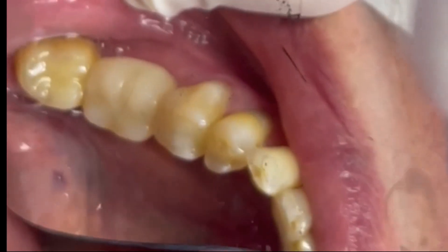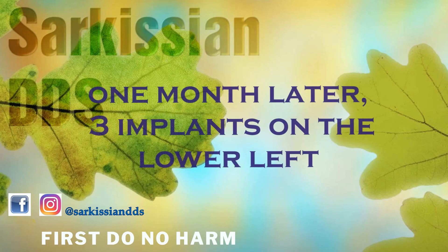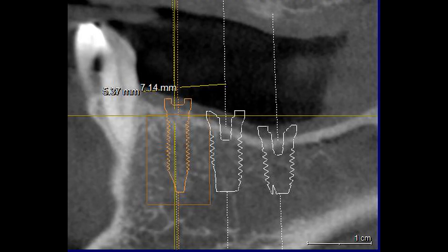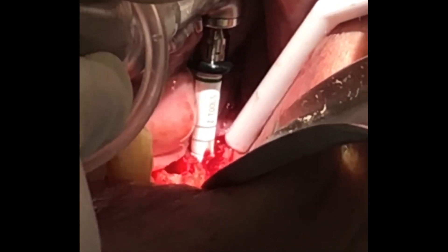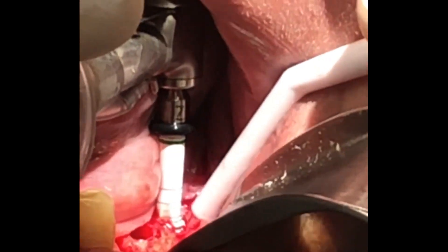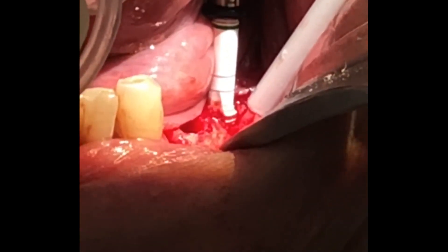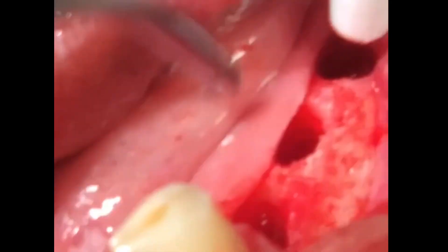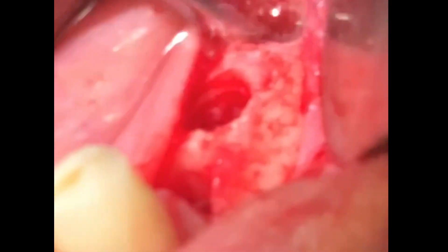This upcoming segment, where we place three implants on the lower left ridge, was one month after the implantation of the first implant on the lower right. We follow the same principles, just with a little more meticulous planning on the positioning of the implants because they are three consecutive ones and we have to maintain ideal distance from each other.